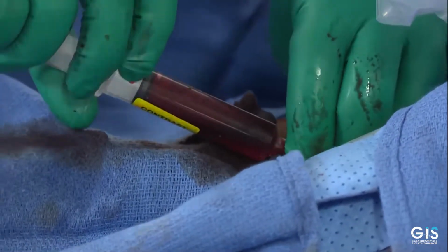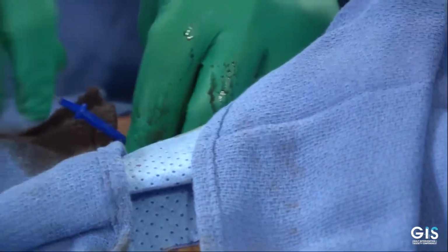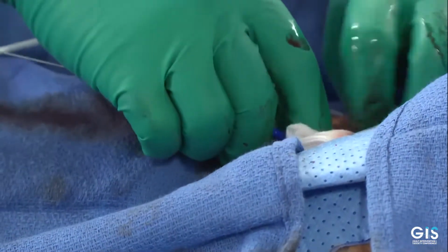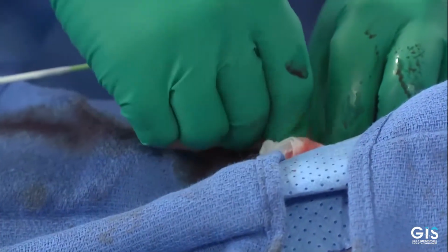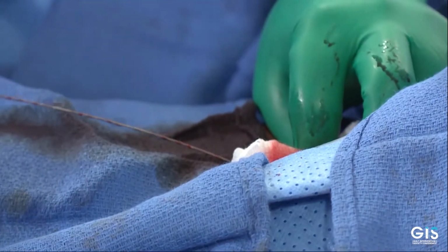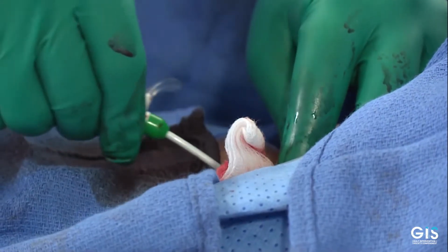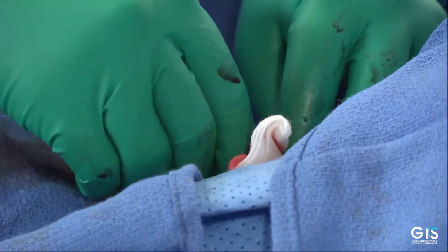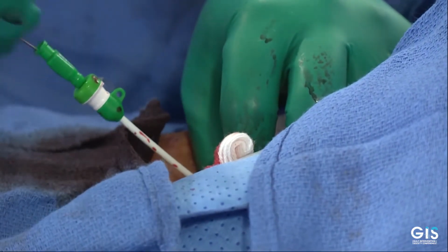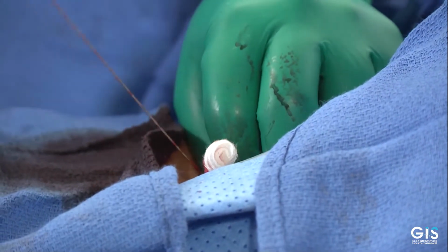Okay, so pull the table back, Salim. Okay, so now we exchange for a 6 French sheath. Normally at this time of the procedure, 6 French goes first just to dilate, and then everything comes out, and then we use the ProGlide to pre-close the arteriotomy site.